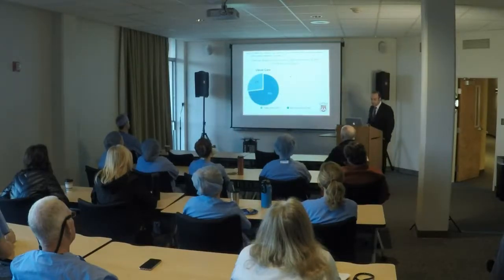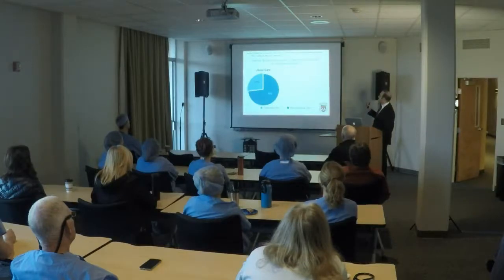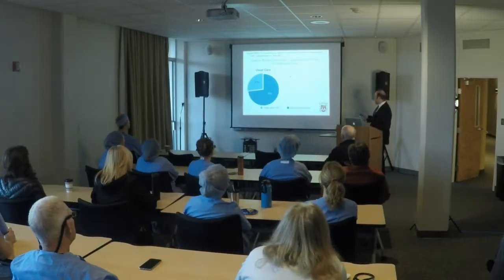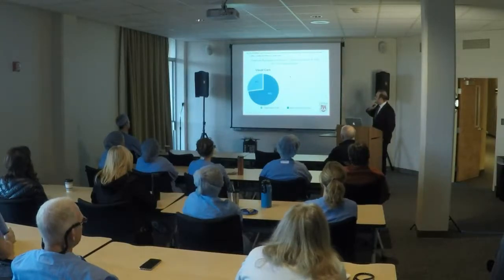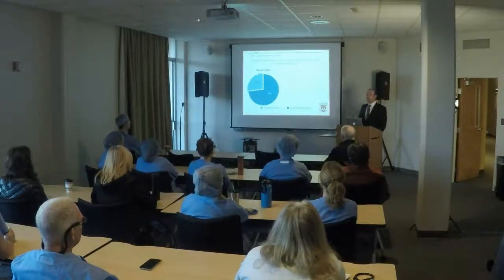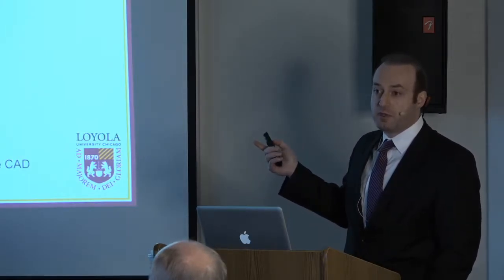Now this is data from the PLATFORM study, which was a clinical utility trial comparing 2 distinct management strategies, basically usual care compared to an FFRCT guided strategy. And what the PLATFORM investigators were able to demonstrate is a dramatic reduction in cath with no obstructive disease. And if you recall from that New England Journal of Medicine paper that I presented, one of the earliest slides, saying how this is a major problem in the US, how many of our patients are getting cathed to only tell them they don't have obstructive coronary disease.